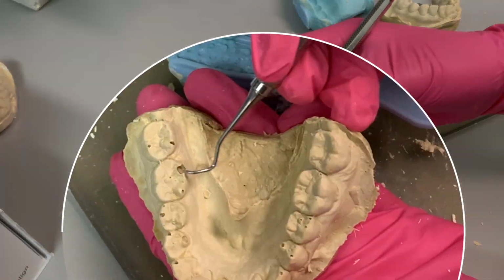So occasionally you have a situation where whatever's going on that day, your model just did not come out perfect. Yes. And sometimes you can still save it, especially for bleaching trays. You have room to kind of slack a little bit. So we're gonna use those messed up models and we're gonna show you guys how you can fix it up and how your bleaching trays could still come out great. So let's just get started.